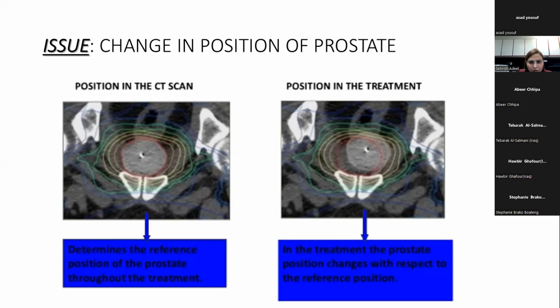Yes, the rule of thumb is for the rectum particularly. You should accept a 4 centimeter diameter of the rectum. If it is more than that, you should not accept it at the time of the planning CT scan.